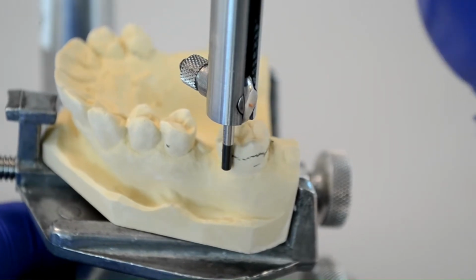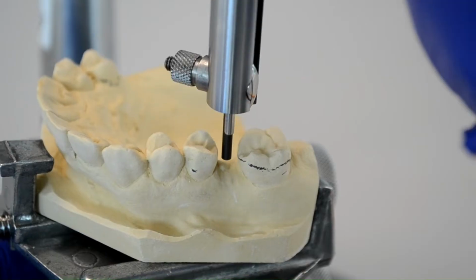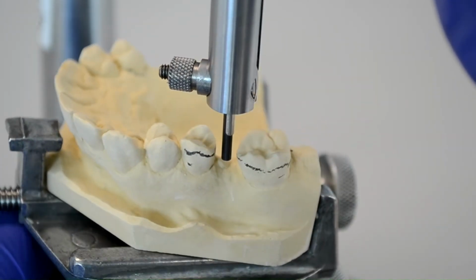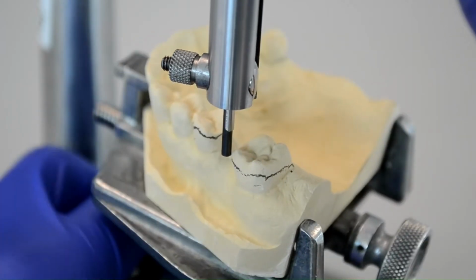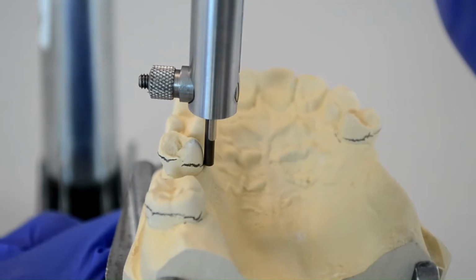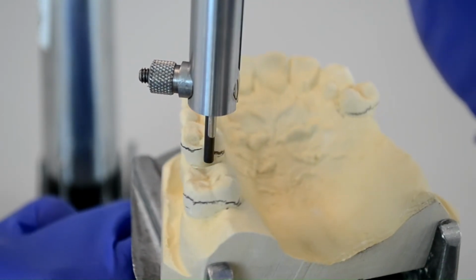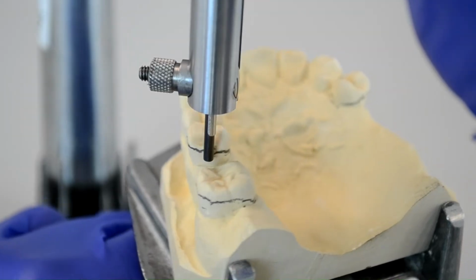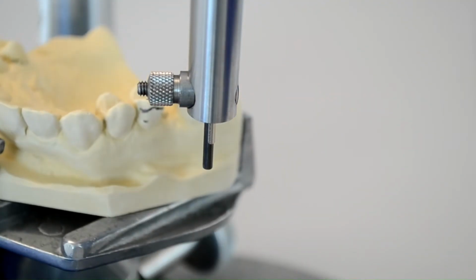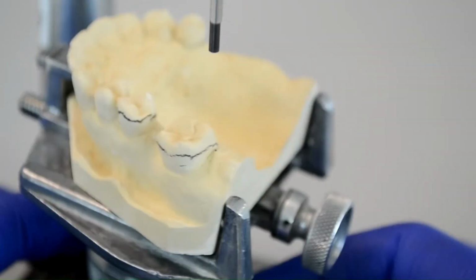Notice how I'm using both my hands to undergo this procedure. The left hand is gripping the base of the table and is used to move the cast around, and the right hand is moving the mandrel up and down and around to ensure that only the side of the lead contacts the tooth. In most cases, only abutment teeth needed by the RPD are going to need to have survey lines drawn on them, and anterior teeth are most likely only going to need to have their facial and proximal contacts surveyed.